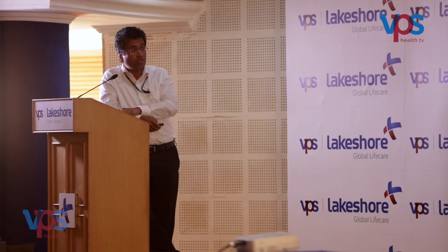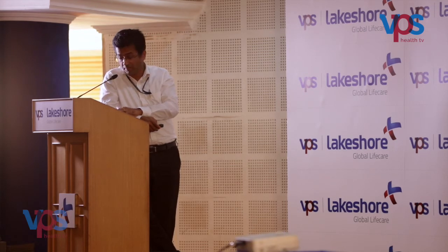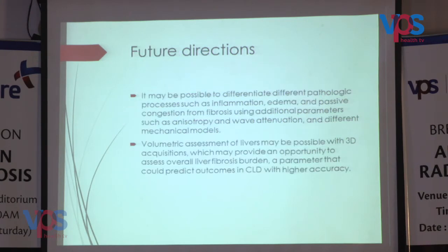There are a few limitations which you need to be aware of. If the liver has iron content, iron overload, it's one potential problem, and also it's a breath hold sequence. The patient has to hold their breath for some period of time for us to get good images. Future directions: there is a possibility of getting 3D acquisition. Also, there is a possibility to differentiate pathological processes such as inflammation, edema, and passive congestion from fibrosis. So very useful applications are likely to emerge in the coming years.